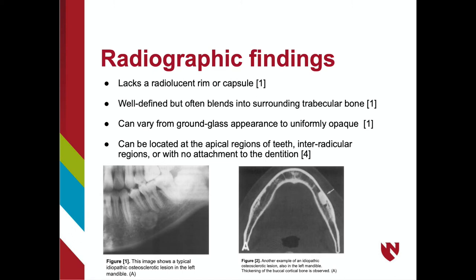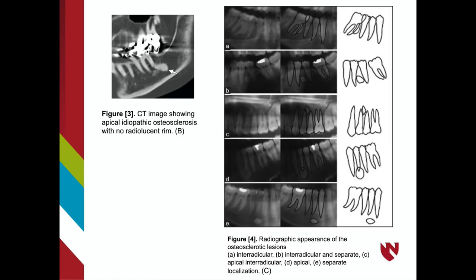Figure 1 shows a classic example of idiopathic osteosclerosis, located in the premolar and first molar region of the left mandible. Figure 2 shows another typical example — this lesion is radiopaque and also located in the left mandible. Figure 3 is a CT image of idiopathic osteosclerosis in the apical region, lacking a radiolucent rim. Figure 4 provides an illustration of the variety we may see: Image A shows an interradicular lesion; Image B is an interradicular and separate lesion; Image C is an apical, interradicular lesion; Image D is an apical lesion; and Image E is a separate, localized lesion.